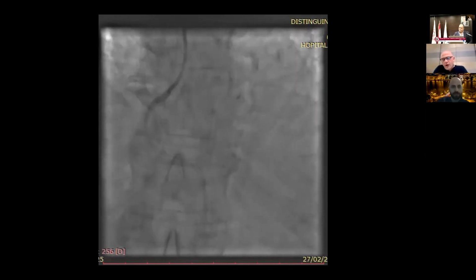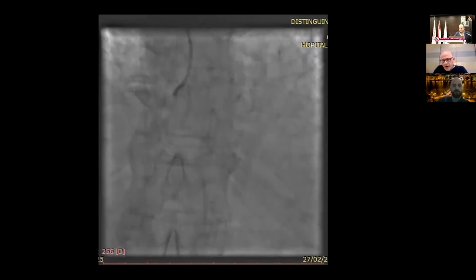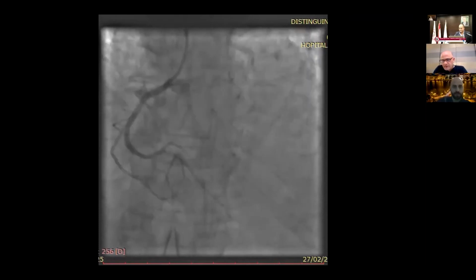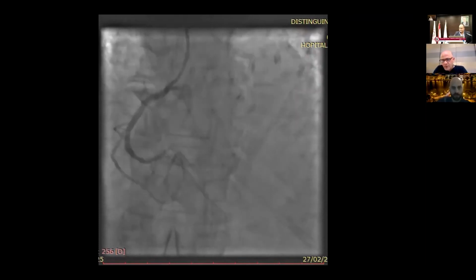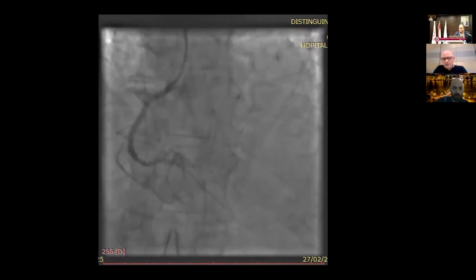So, doctor, you recommend after rotational atherectomy to go with a scoring balloon or a high-pressure NC balloon to prepare the lesion mostly effectively, so as we will not have any problems entering the stent? Yes, definitely. Later on in the session, you will see this in my talk. I have detailed information about this. Okay, thank you. Thank you very much.